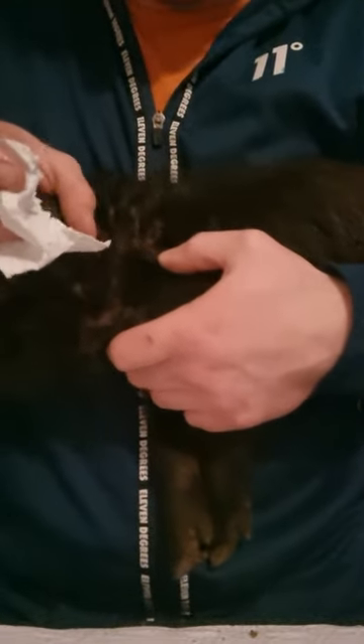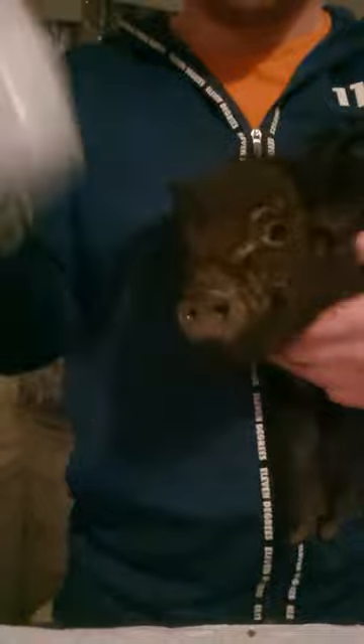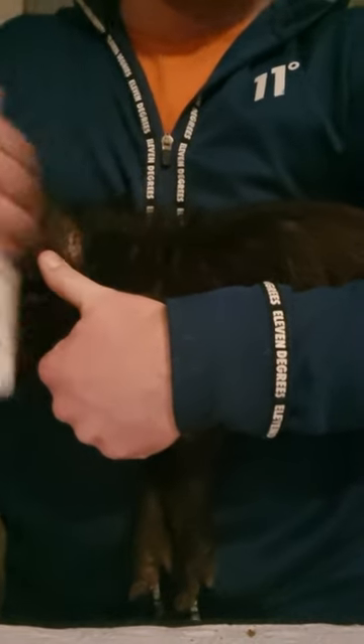Remove your needle. Take a clean bit of tissue, find the injection spot — you'll see a little bit of red there — and just dab that a tiny bit. Then take your Blue Spray and give it a little spray, and that's you done. A good practice when giving an animal an injection would be to rub the spot around so that whatever you're injecting moves around in the muscle. If anyone has any comments, any info, any advice to give to me or to other people that I could add into the video, go ahead — thanks very much.